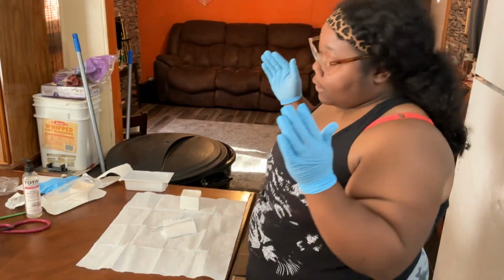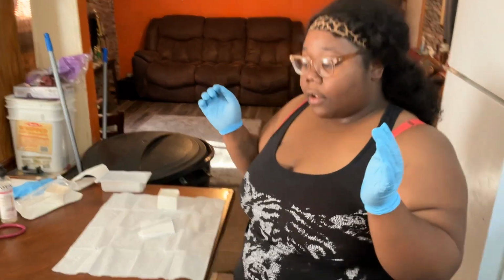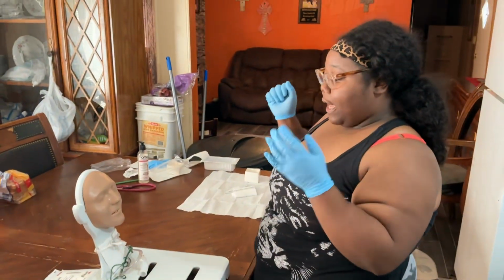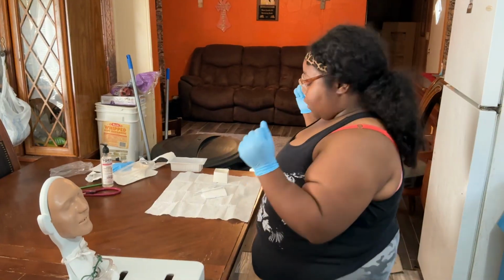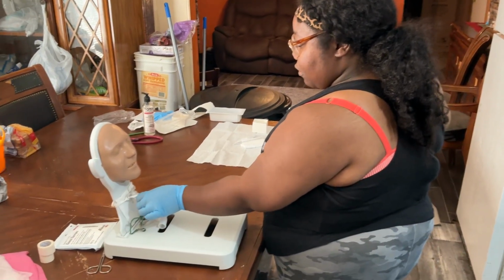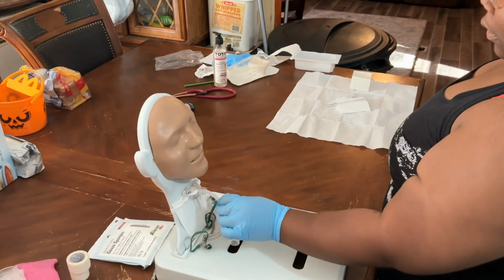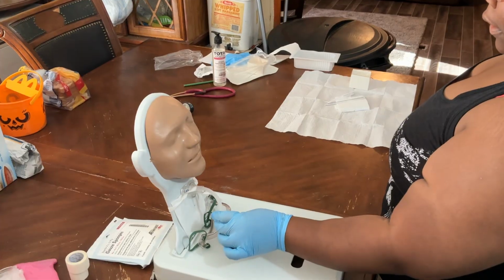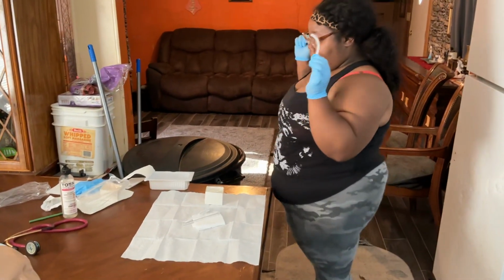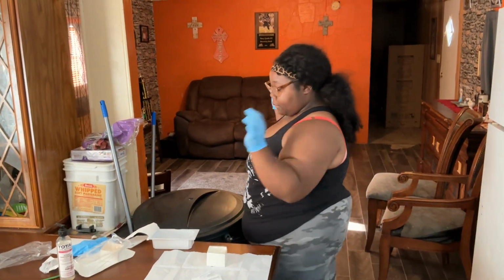Okay. So what I'm gonna do now is come over here to my patient. This is my dominant hand, non-dominant hand. This will be my clean hand. This is my dirty hand. What I'm going to do is take my patient's plug out. Alright. I'm going to come around my sterile field, put it inside of my solution.